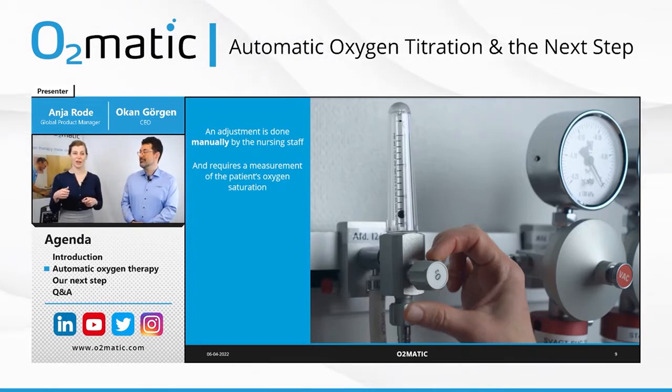And if you have the time, you should actually stand and titrate until the oxygen saturation is stabilized, or go back and measure once more. But I remember that it could be hours between. Some patients maybe only got a measurement 3 or 4 times every day, and not the 50 times every day that we know from our data is needed to keep the patient stable.